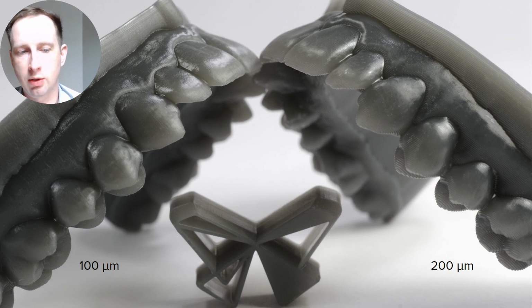Side by side, so on the left here you can see this is the same print at 100 microns, on the right 200 microns. I mean, both are beautiful, but really you can see the difference with this photo of what the two look like.